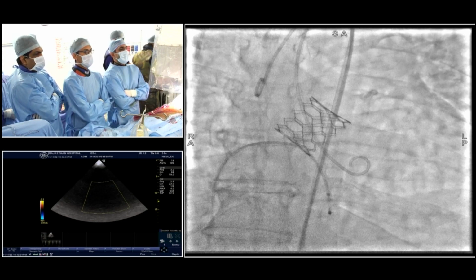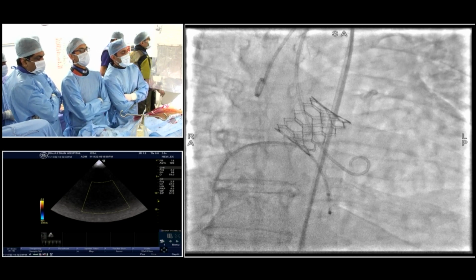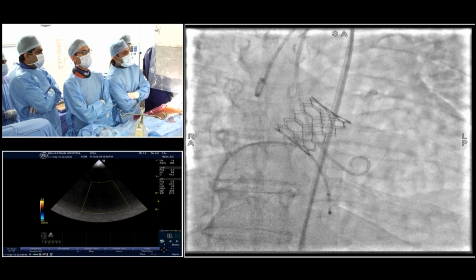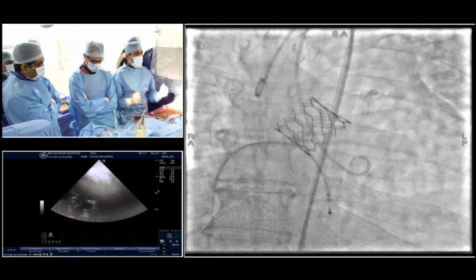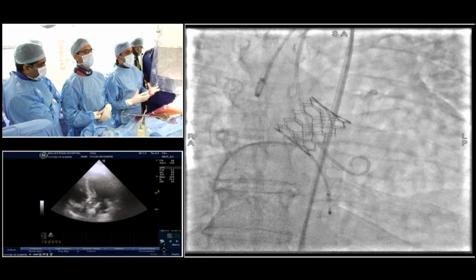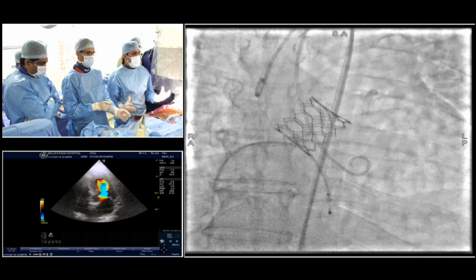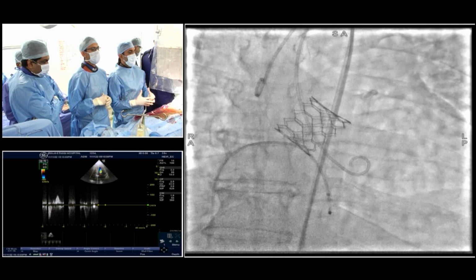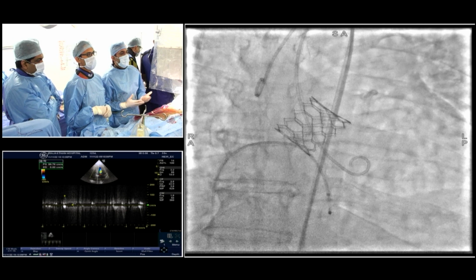That's a very good discussion of pre-dilatation versus no pre-dilatation. In a self-expandable valve, like an Evolut R, Portico, Navitor, and the Boston Scientific valve, there is an interaction between the force of the leaflet and the opening force of the valve. So the softer the valve, the more pre-dilatation you need. With the Boston valve, you have to pre-dilate with an average diameter of the short and long axis. You're not even choosing the short axis, because the lower end of the frame might not be able to fully open a calcified valve.